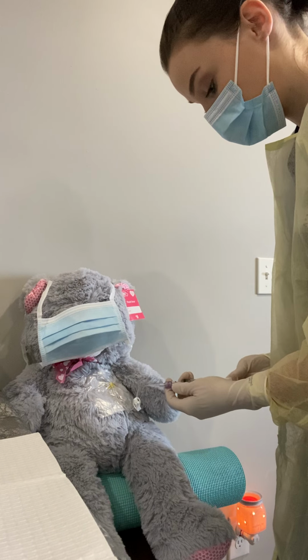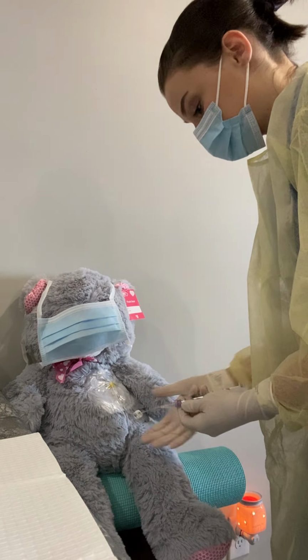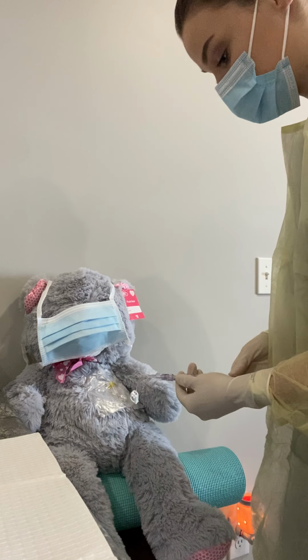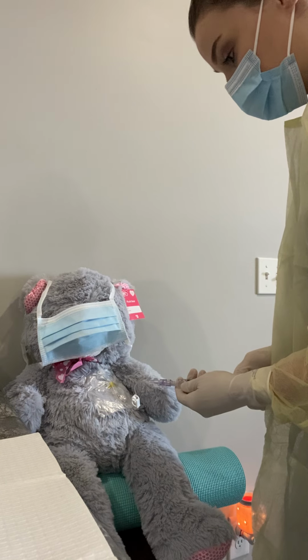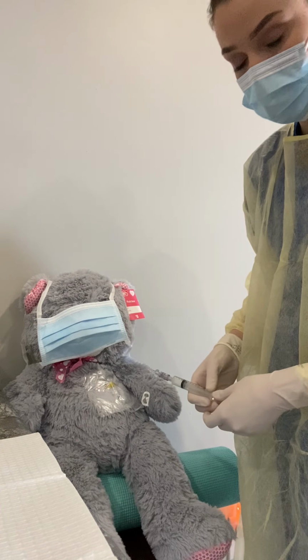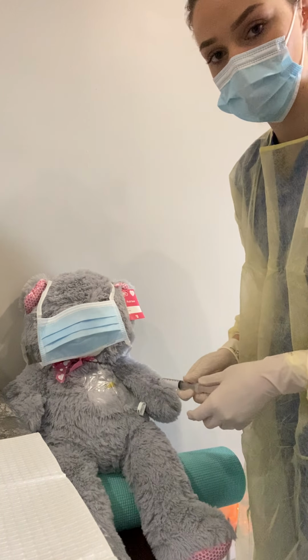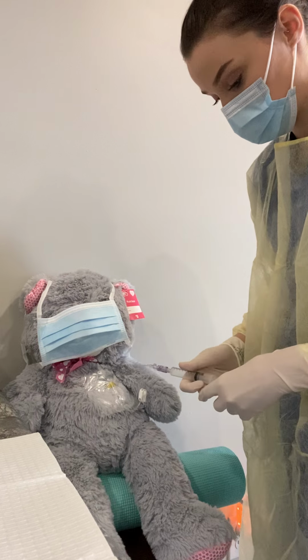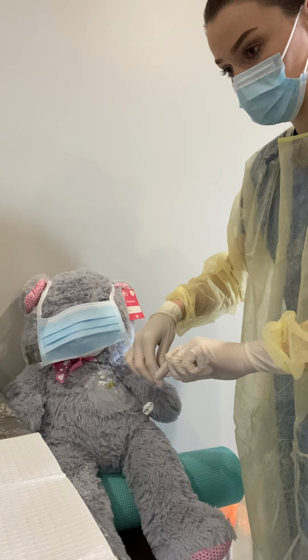What I should be pulling back first is the air. So that'll prime my tubing. So I pull back the air, and then I'm going to pull back, it should be clear, which is the heparin, and then blood tinged. That means I know that my placement is correct. So I've got that all pulled back. So I'm going to disconnect this.